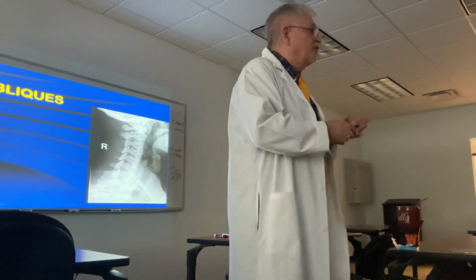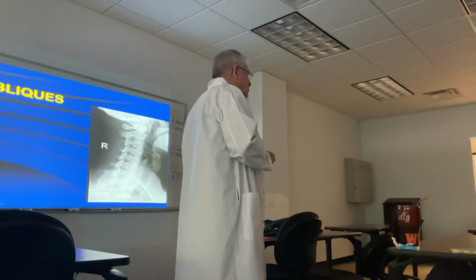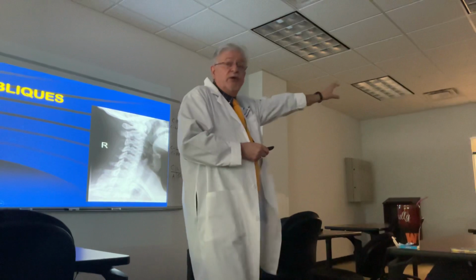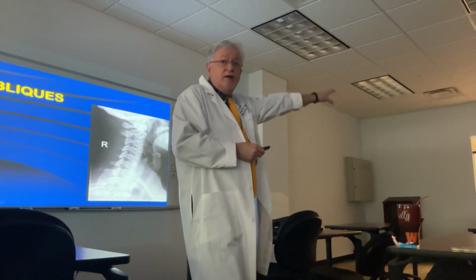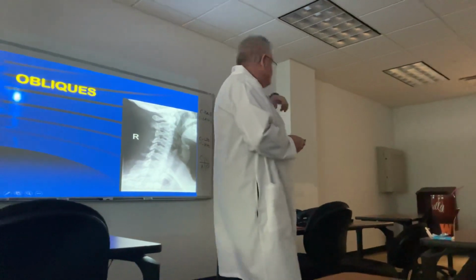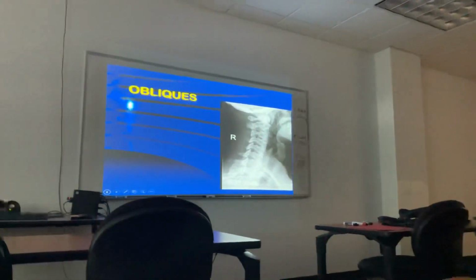We follow the convention, we mark the side that's closest to the film. What happens out there, we have no idea because we don't know which school they went to, what kind of training they got, but that's how mistakes happen. Okay? All right.